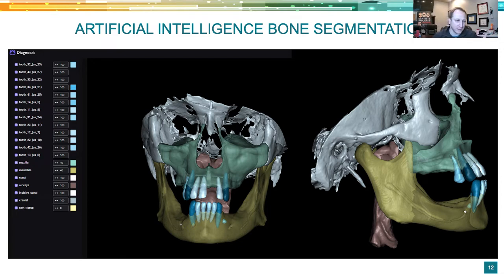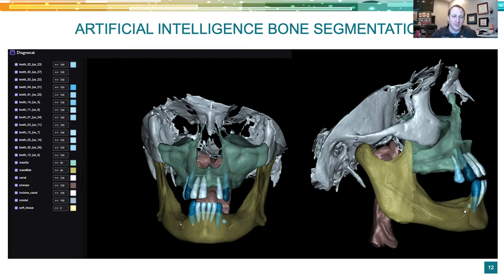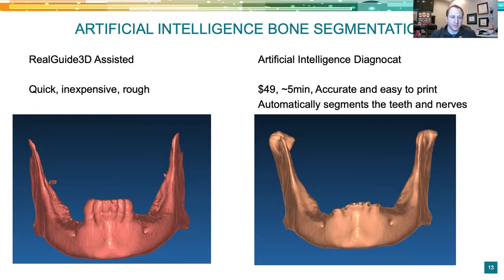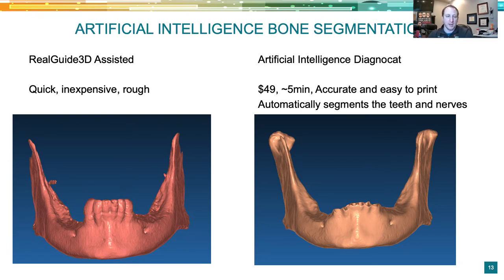What can we do with this? We can overlay it into our treatment plan, bring it back into our CT, look more specifically at root form, or 3D print the teeth. What we really want to do is print this. Here's the RealGuide 3D — quick, inexpensive, rough draft. Then the AI version — $49, five minutes, super accurate, easy to print, and you can toggle on and off the teeth and nerves.